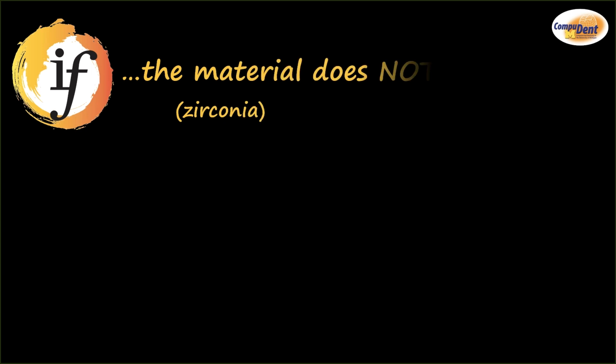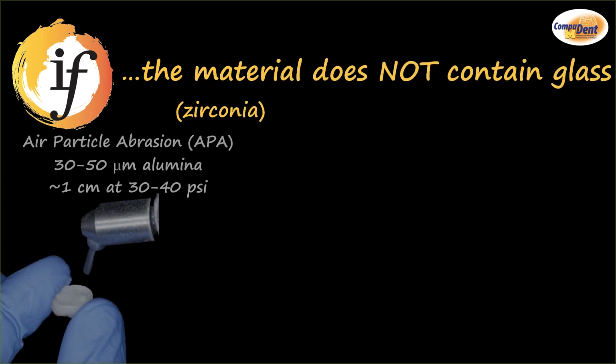On the other hand, if the material does not contain glass, which is zirconia, we can't use hydrofluoric acid. It won't do anything but clean the crown. So we're going to use air particle abrasion, about 30 to 50 microns of alumina, at about a centimeter away, 30-40 psi, 10-15 seconds.